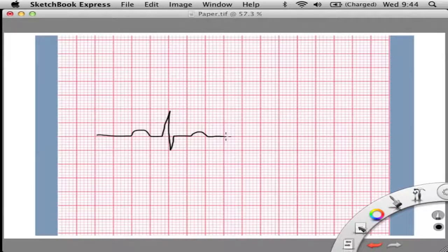So you may not have that Q wave. You may not have an R wave. You can drop these, and that's something to know. When we talk about the different things we're going to look at when we're looking at rhythms, those are things to note. And that's all going to go into your mind, just like last week, where we talked about chest pain and what it could be. It could be this, this, this, or this, and we kind of started ruling stuff out or ruling stuff in. We're going to do the same thing whenever you're analyzing cardiac rhythms.